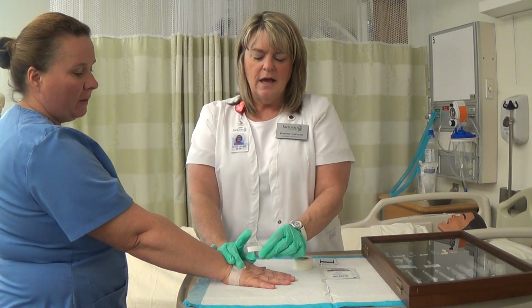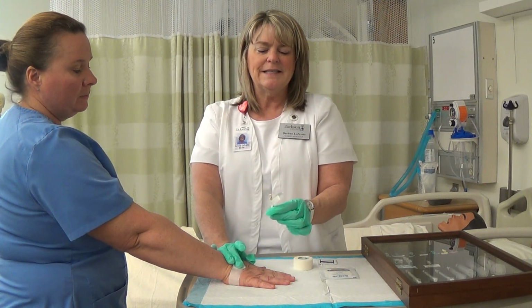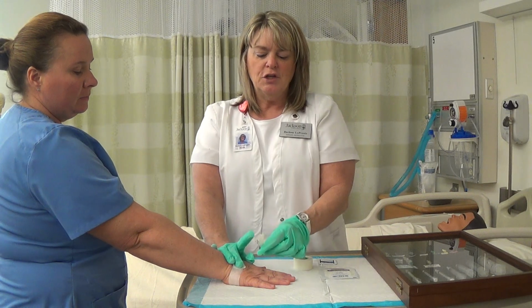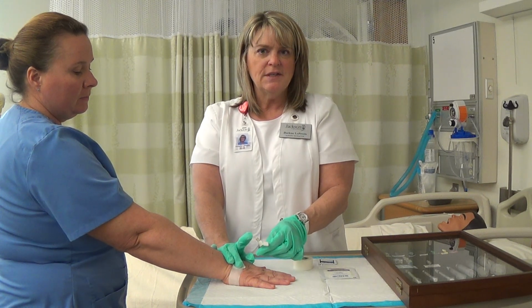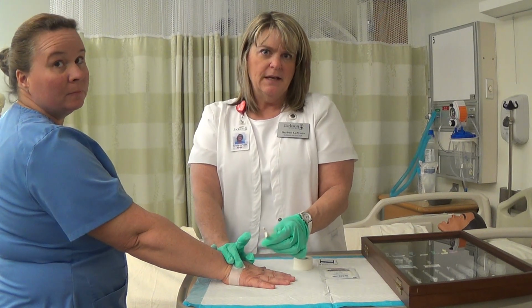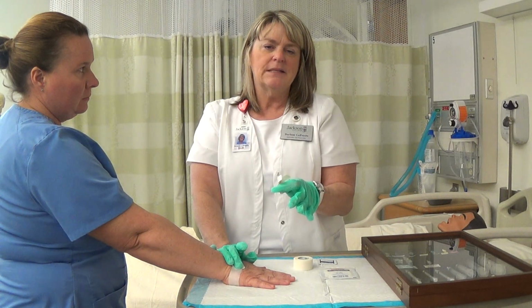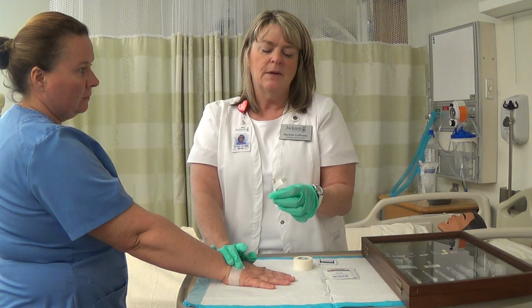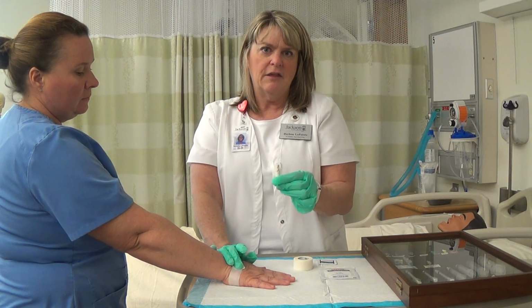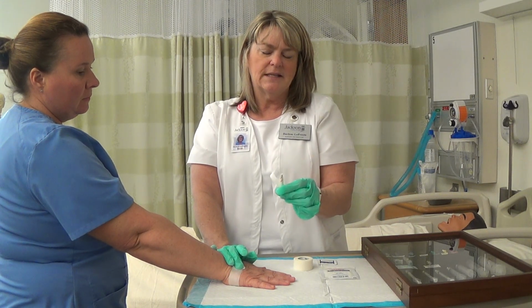And then you want to assess the tip of that catheter that was in the patient. You want to make sure it's intact, is what we call it. You don't want to notice any tears, or if it appears like it was torn or ripped or part of it is missing, that's not a good thing. That means it's circulating around in the client's body, and that's called a catheter embolism. So you want to inspect the end of that catheter, and if you're not sure, again, have one of your instructors or another nurse assess that with you.